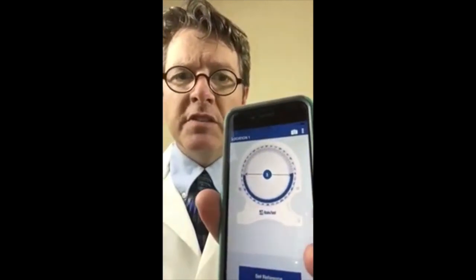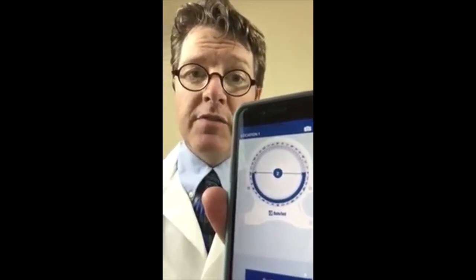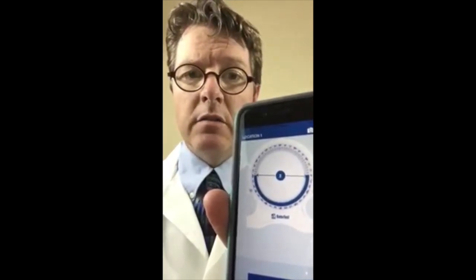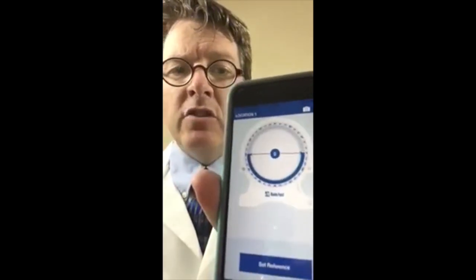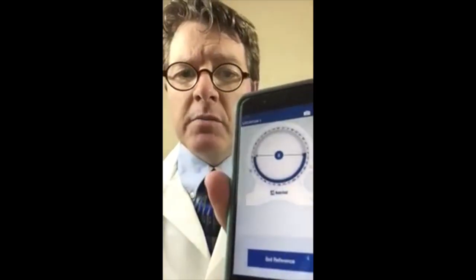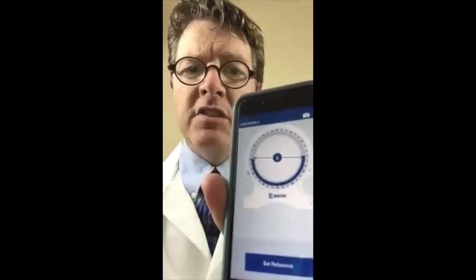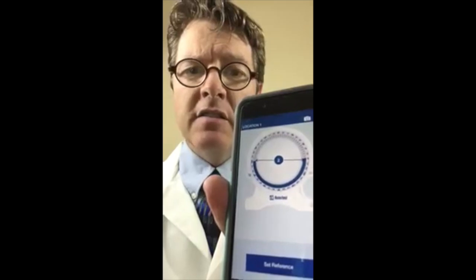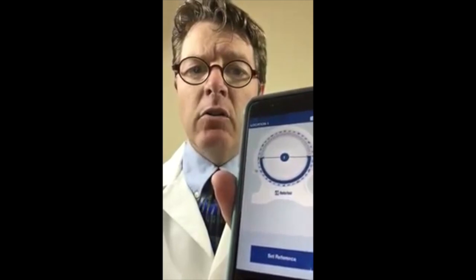First of all, what is an inclinometer? An inclinometer is a device used for measuring specific angles and degrees of motion in the spine, specifically during impairment ratings. This device tracks the degrees of motion as the patient moves their spine through space. What's special about this is that it is a dual inclinometer. Dual inclinometers take measurements at both ends of the spinal segment and subtract the two to give you a true spinal angle motion.